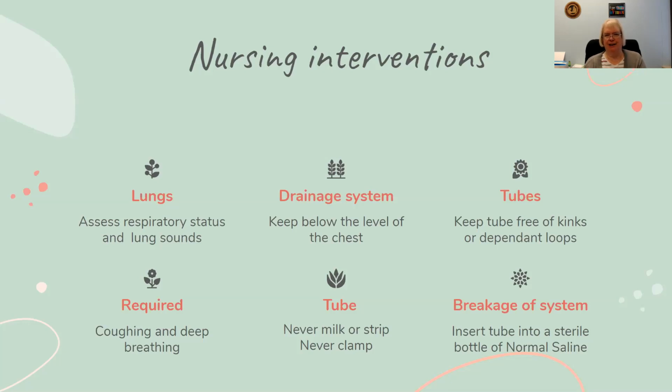And the last thing, and it's not on the slide here, is if the doctor is coming in to remove that chest tube, we need to have instructed the patient to do the Valsalva maneuver. We don't want them inhaling or exhaling while that tube is coming out. So we have them take a deep breath and bear down like they're going to have a BM, okay? And that will help with that. Okay, so this is just a quick review, not as long as some of my others, but it's a quick review of what we need to do for chest tubes.